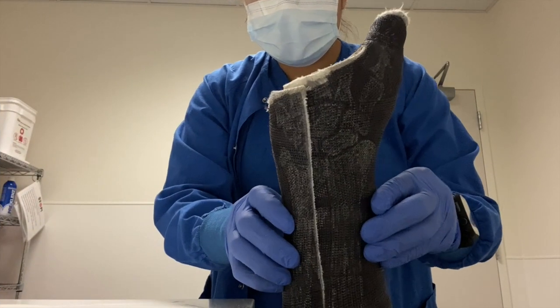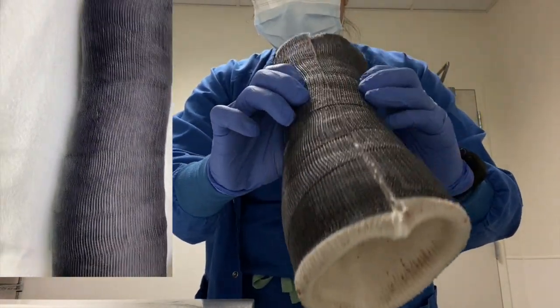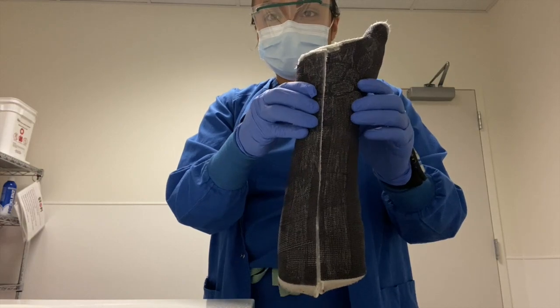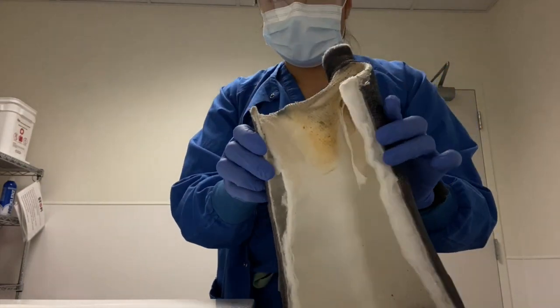I also applied this short arm thumb spica cast a couple of weeks ago. The patient returned today so I could remove the cast — it feels pretty awesome to remove a cast that you applied yourself, because the patient just looks so much happier when it's done. The patient drew all their bones on this cast and actually wanted to keep it, so I'm going to remove the padding and give it back to them.